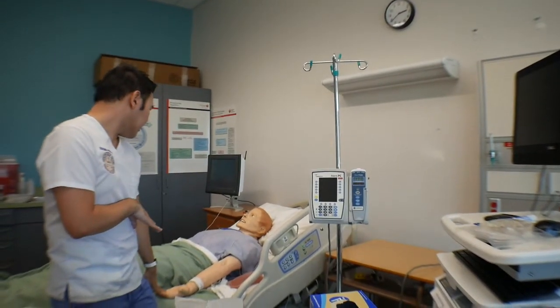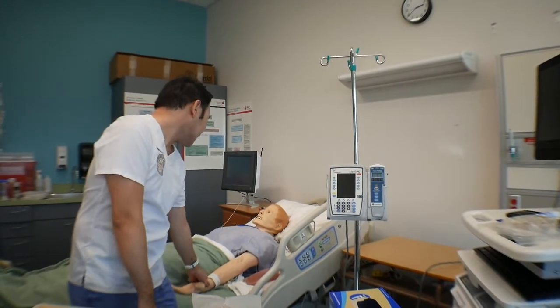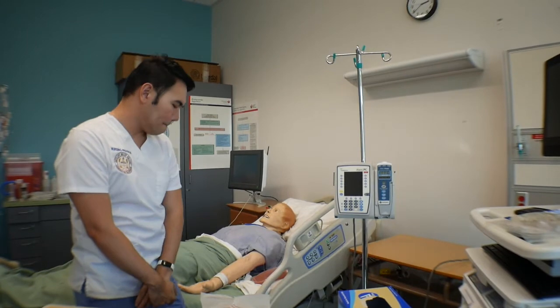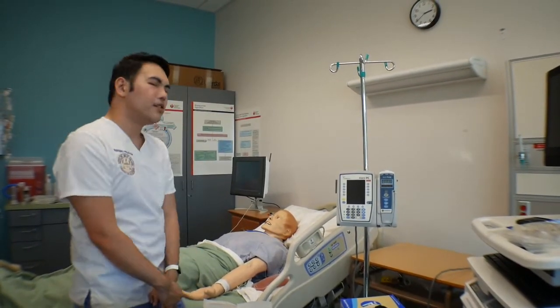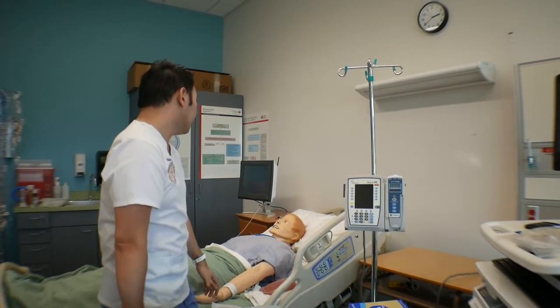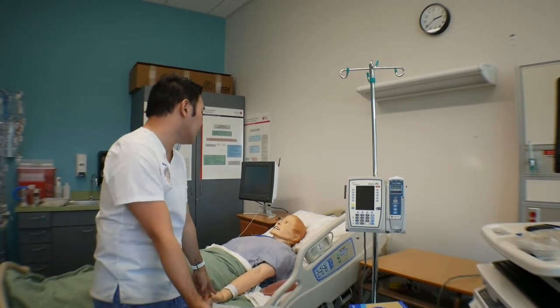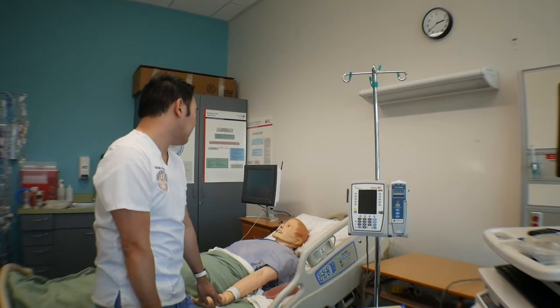Hello. Can I verify your name and date of birth, please? John Smith, February 2nd, 1969. Alright, thank you. This is actually a good opportunity for you to tell them what you're going to give them. So, Mr. Smith, we're going to give you an infusion of normal saline in a bit. I'll be right back, okay?